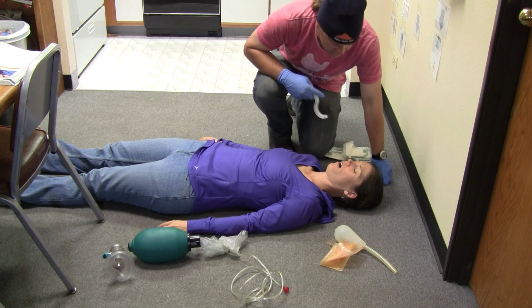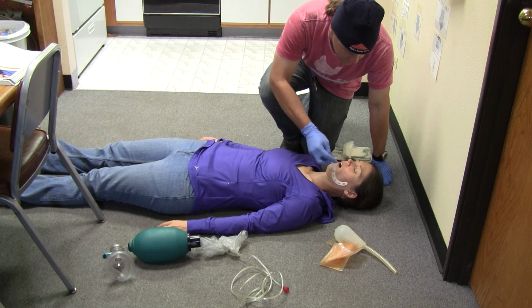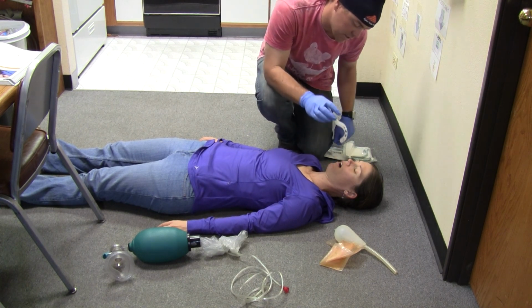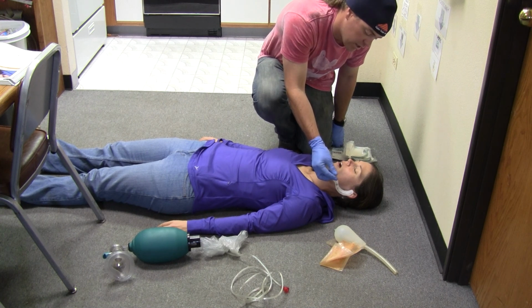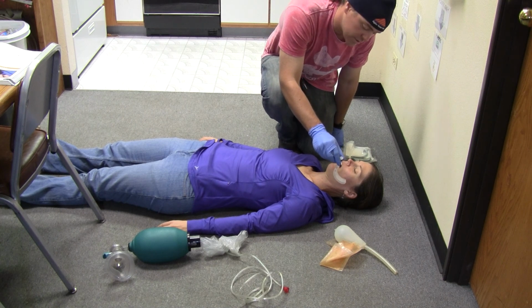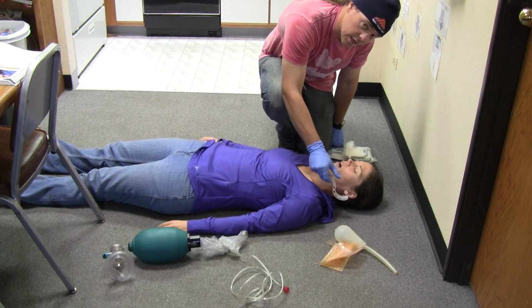You're going to size these from the mouth to the ear, just like that. You're going to take it backwards, just like this, slide it into the mouth, and turn, just like that, so it'll depress the tongue and keep it from occluding the airway. You can't slide it in like that because you'll shove the tongue back into their throat. So this is the most important part about putting an OPA in: you slide it in like this and twist it as it goes in.